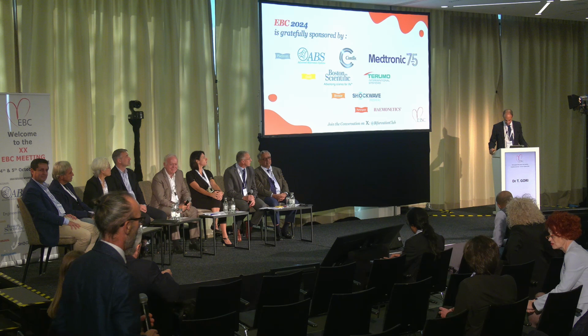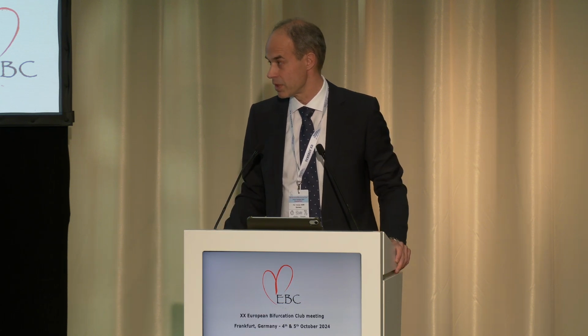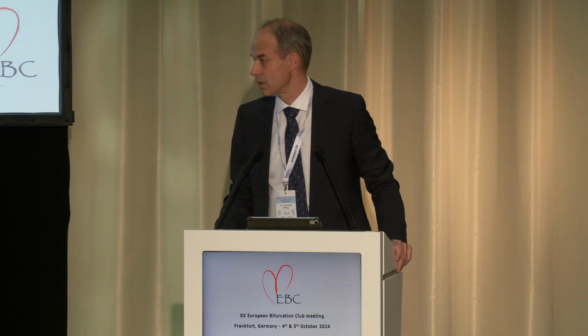Yeah, actually, I understand, I agree with it. One very, very important point, as you said as well, is the alternate dilatation with high pressure, which was not in the DK crush procedure at that time. Yeah. Patrick is right. We are completely crazy.